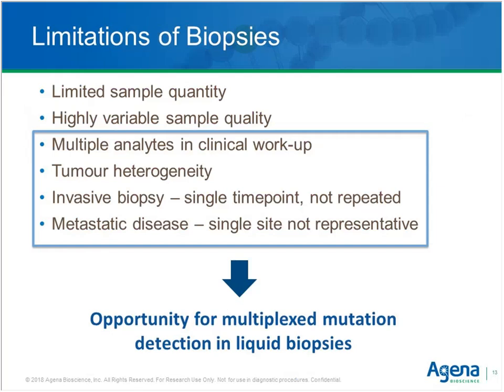the tumor heterogeneity, the problems of the invasiveness of taking a biopsy, and the fact that we may have to deal with a metastatic disease where there is remote site shedding or tumor involvement, and couple this with today's desire to interrogate not only a single marker but multiple markers at the same time. All this taken together is a great opportunity for multiplexed mutation detection in liquid biopsy to go into the clinical routine.